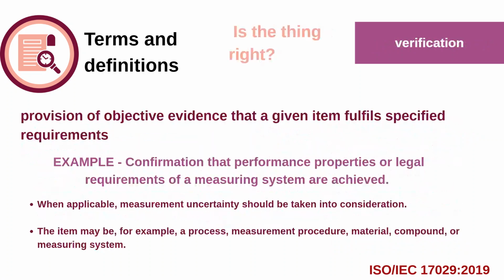And then comes a very important terminology, verification and validation. To say it very simply, verification is checking whether the answer you received is correct or not. I am measuring voltage, and if I'm getting the output in terms of resistance, then it is not acceptable.